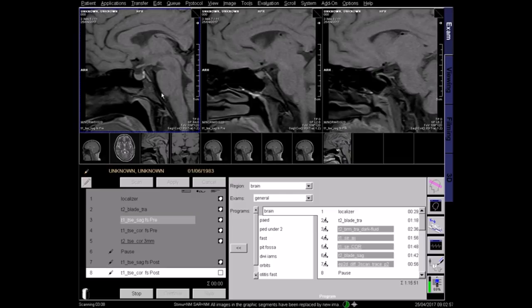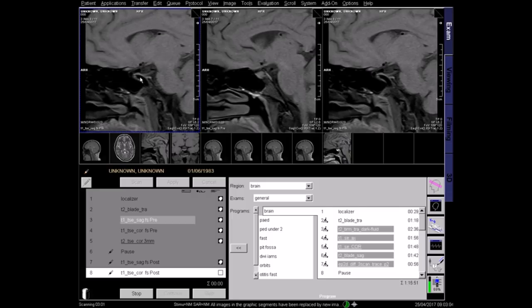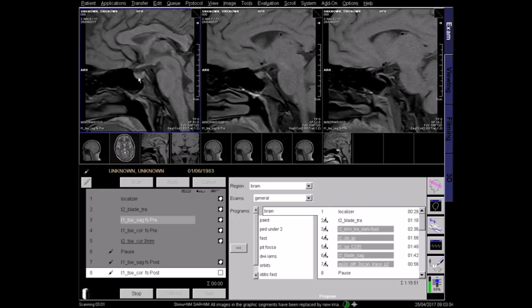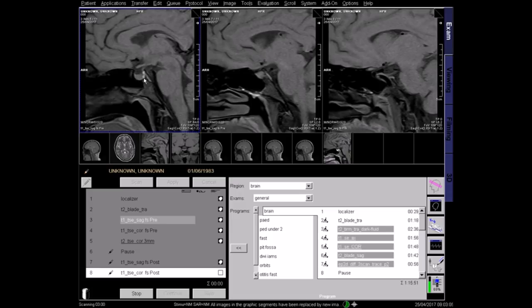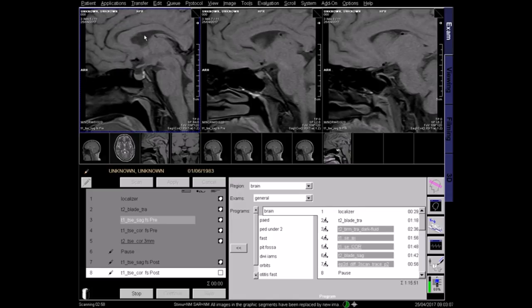This is the T1 sagittal fat-saturated sequence. This is the pituitary gland and the corresponding pituitary stalk. Ensure sufficient coverage from side to side. Notice the dark fluid in the lateral ventricle, which is characteristic of a T1 image, where fluid is dark.